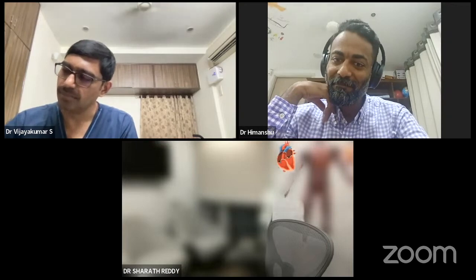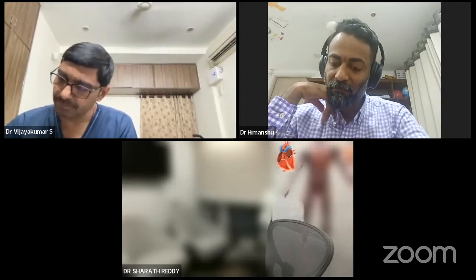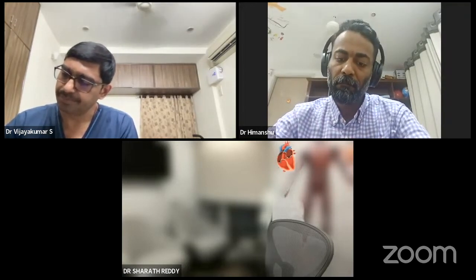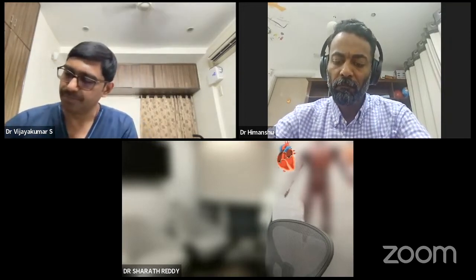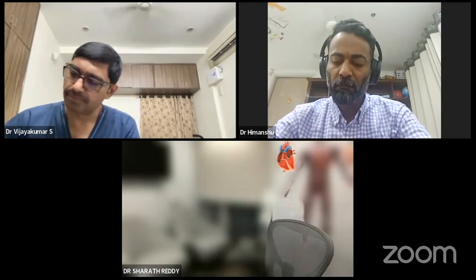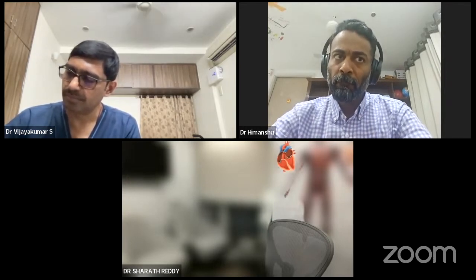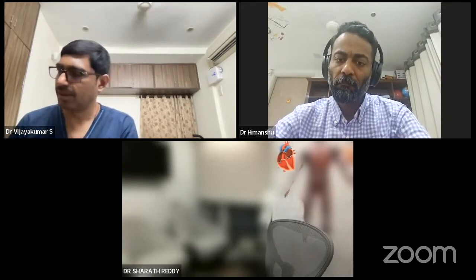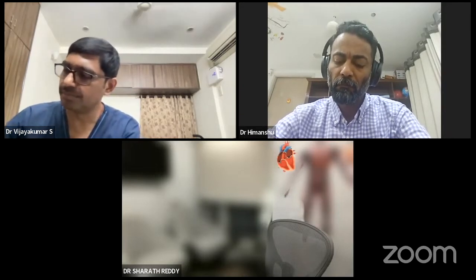So our plan is, in this patient, septal collateral is the safest interventional collateral compared to epicardial collateral. So that's why we preferred septal collateral. And the patient had an SVG to distal RCA, but that is totally occluded, almost more than 7 years. Had it been less than 1 year, I would probably have gone through that SVG. But it is more than 7 years. Also, an important thing is that the CTO is extending beyond the SVG distal anastomosis up to the crux. So that is another reason why the SVG doesn't work for this patient. SVG is not a great collateral for this patient. Otherwise, yes, that would be safer than septal collateral.